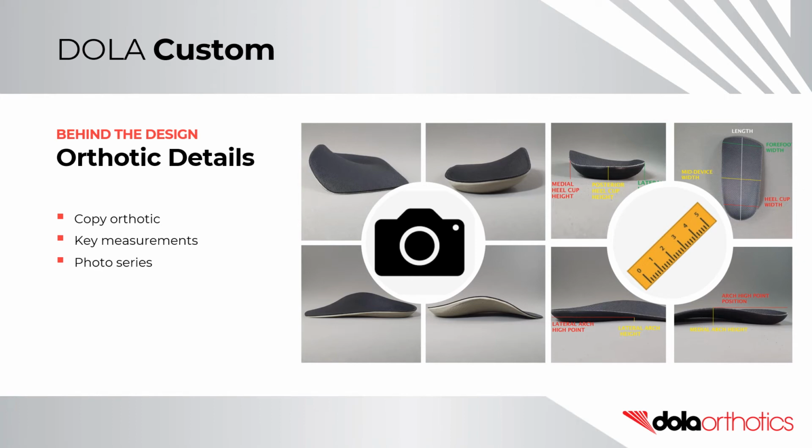If you're trying to copy a successful orthotic, key measurements should be provided, including the length, forefoot width, mid-device width, heel cup height, medial arch height, lateral arch height, and high point positions. It is also useful to send a photo series. This allows us to identify any orthotic features and match them.